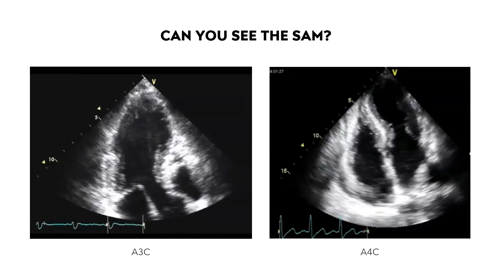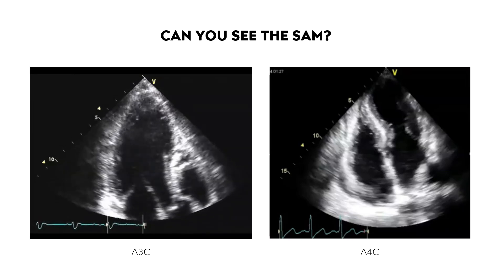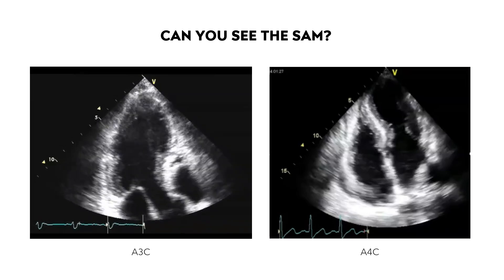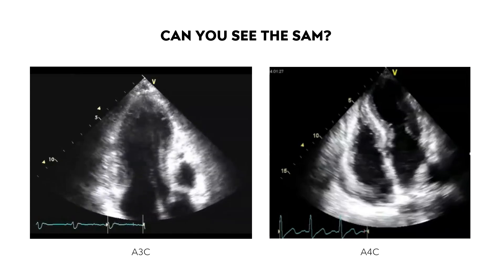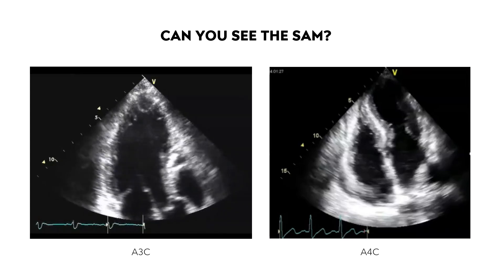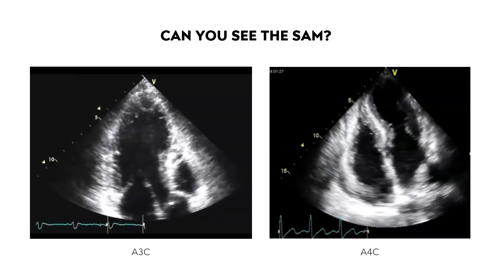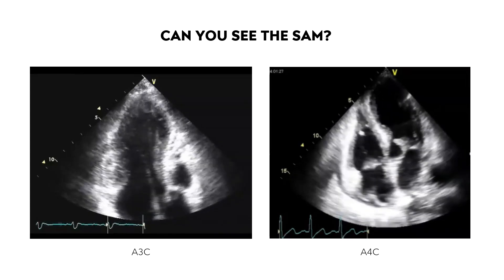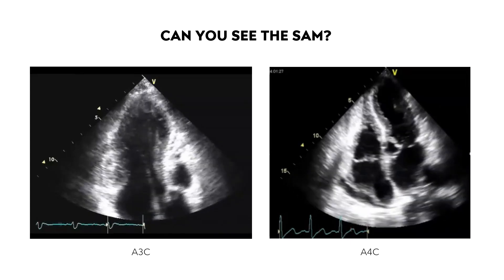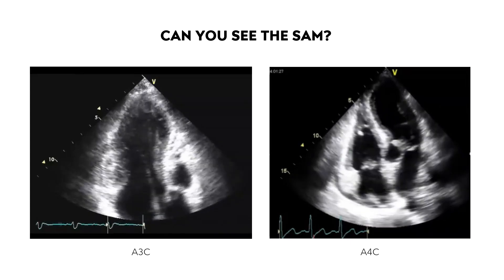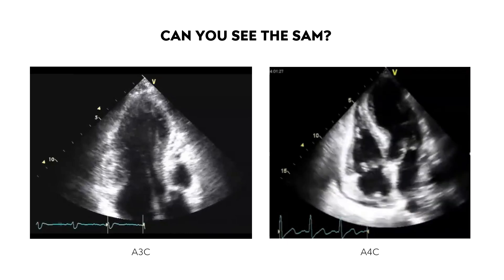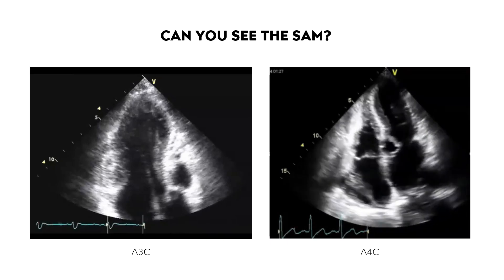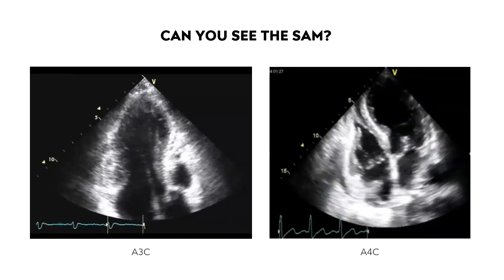Here are two clips of SAM. In the apical 3-chamber view, slowed to half speed, can you see the anterior leaflet of the mitral valve touch the septum during systole? Now in the apical 4-chamber view — also slowed down — there is still an anterior leaflet of the mitral valve touching the septum, leading to LVOTO.